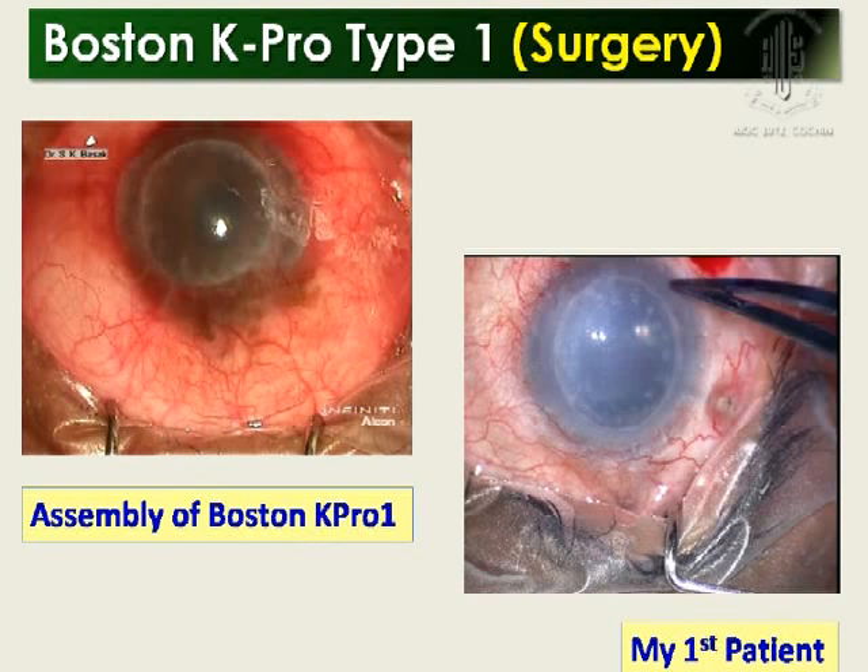Put the front plate, then shift the donor button there. I put a few drops of viscoelastic in between — preferably a higher-viscosity viscoelastic. Then this is the 16-hole back plate, 8.5 mm. Push it a little bit, then take the titanium ring. Placing the titanium ring is very crucial. Once you slip it — if there is an increased gap in that area — you will have problems. You hear a distinct click there. After that, shift it to BSS and keep it safely.